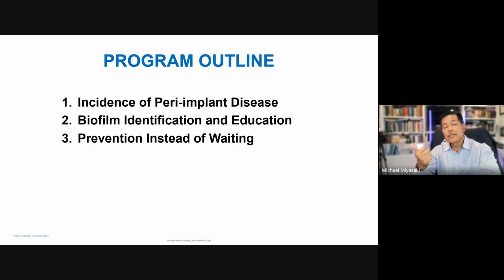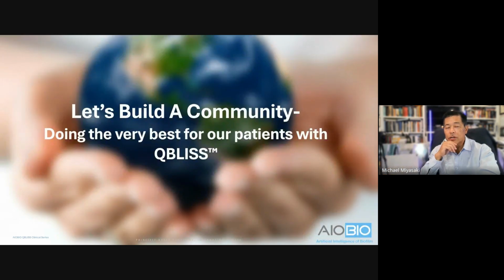So we talked about the incidence of the peri-implant disease, how we identify the biofilm and educate our patients very quickly, and then how we try, in our practice, to prevent peri-implant disease instead of waiting for it to occur. And those of you that are, again, from all over the globe, I really want to thank you for attending these programs. We want to give you some quick insights into how we're actually using this. It's something that our patients really appreciate. Our team really enjoys showing the patients.